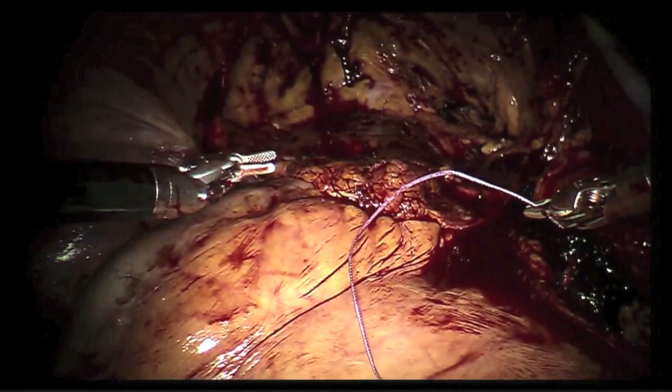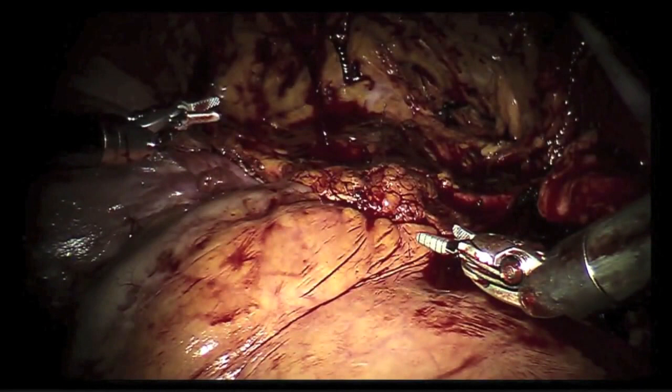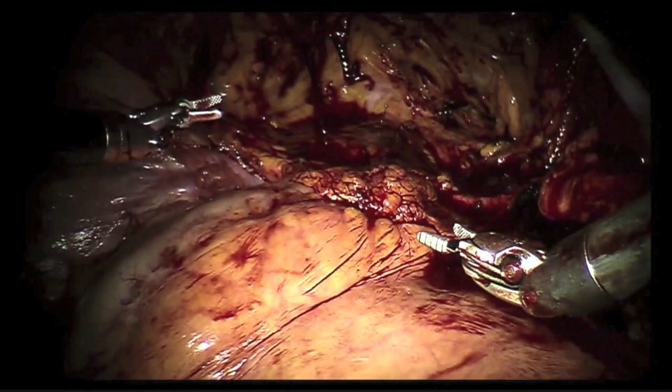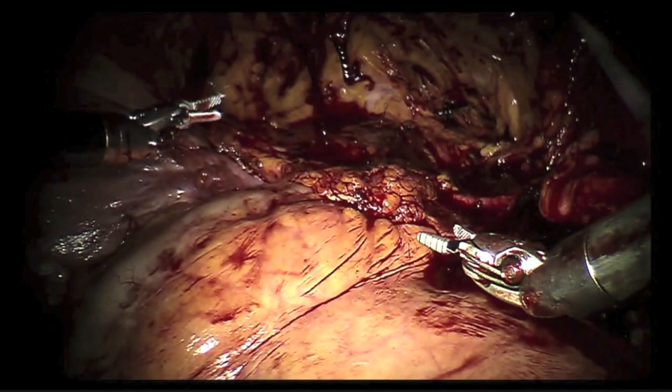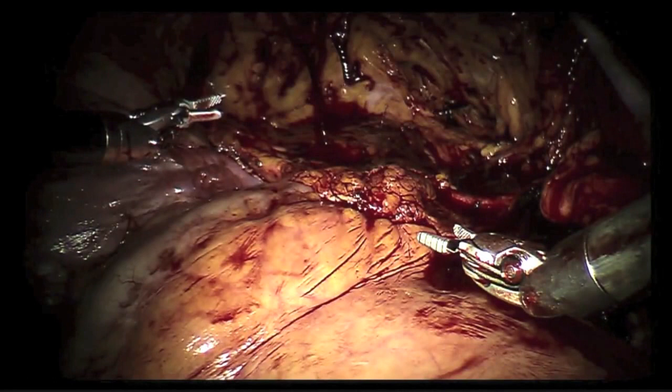Dr. Gill, you didn't do an anti-reflux tunnel as far as I saw, right? Not in this one because the bladder was really thin and I made that inadvertent hole into it. So we just used that. The fact that it was so thin suggests to me that it's going to be difficult to have enough muscle. I didn't see this as a very nice, juicy detrusor. But typically, we are able to very nicely do submucosal dissection, raise the flaps on both sides, and do anti-reflux. So typically, it goes very nicely. This bladder just did not lend itself to it.